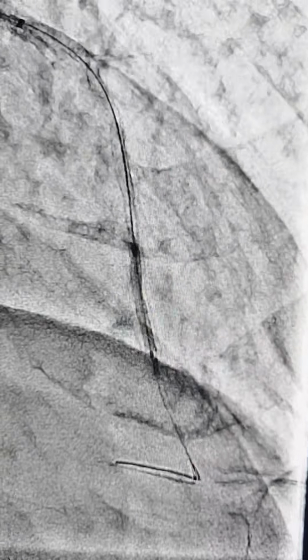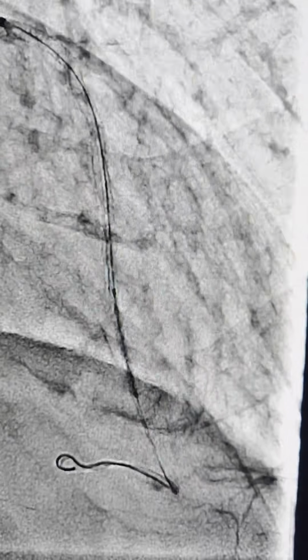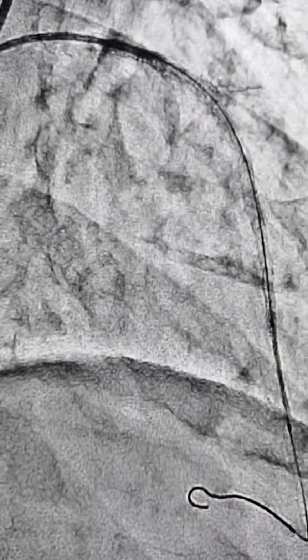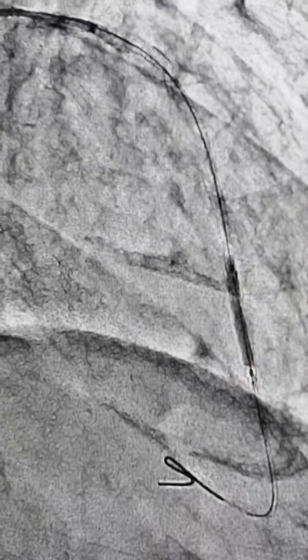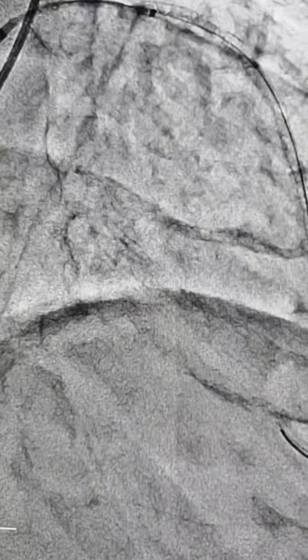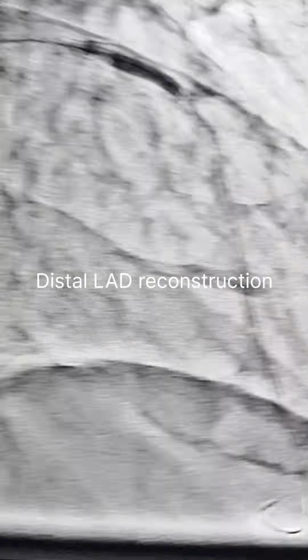This is the stent that I now put in, a 2.25 here distally, after initial dilatation. And now I'm going to do a lot of NC ballooning, and distal also I'm going to try and see.